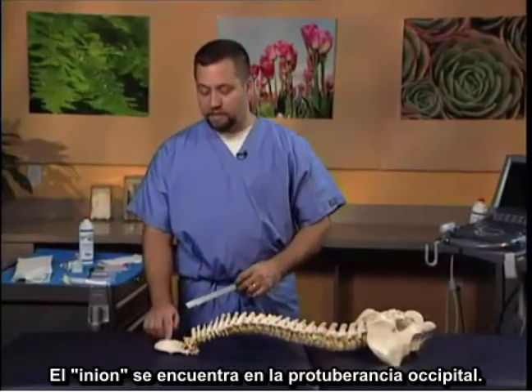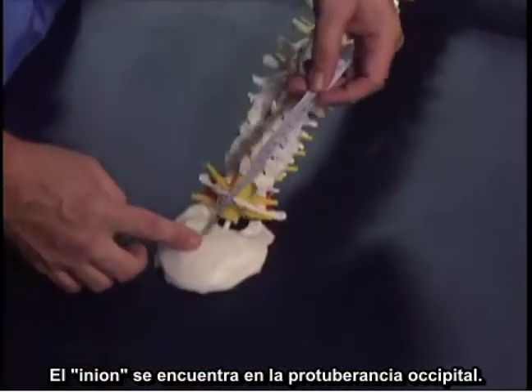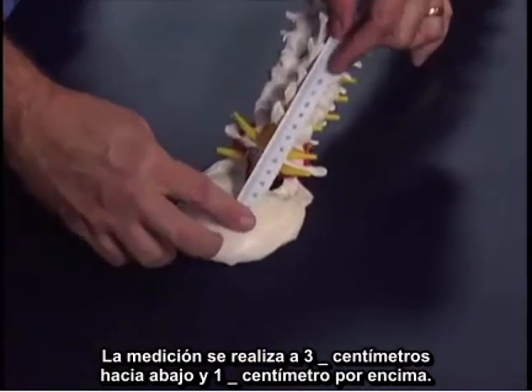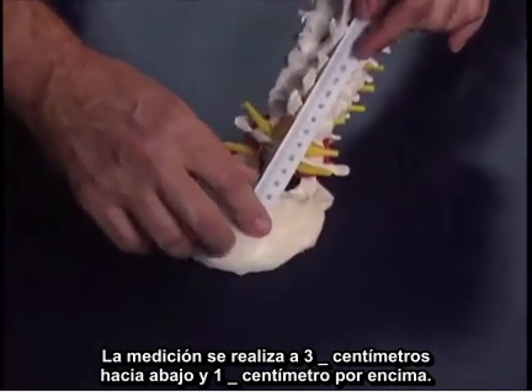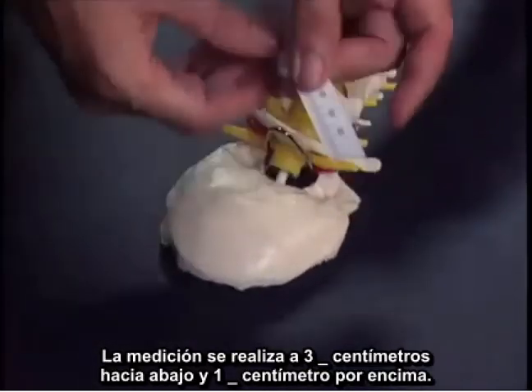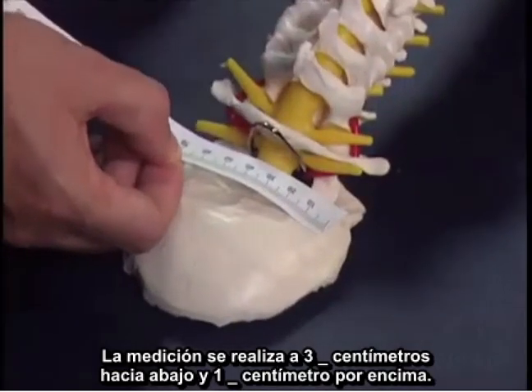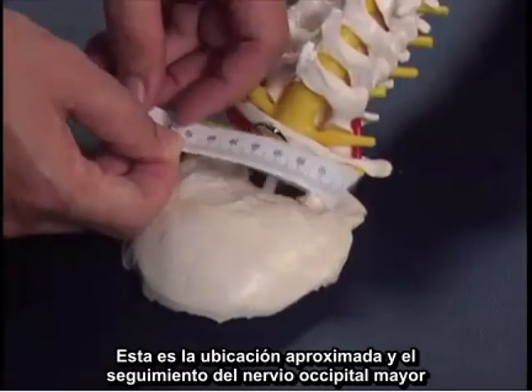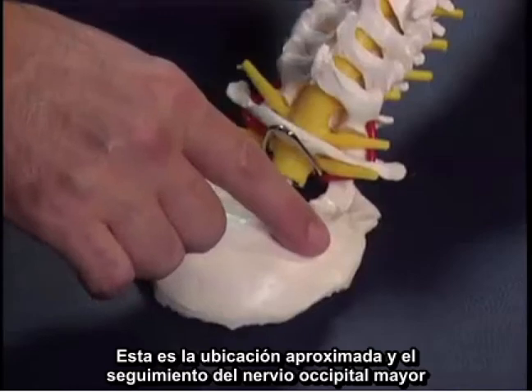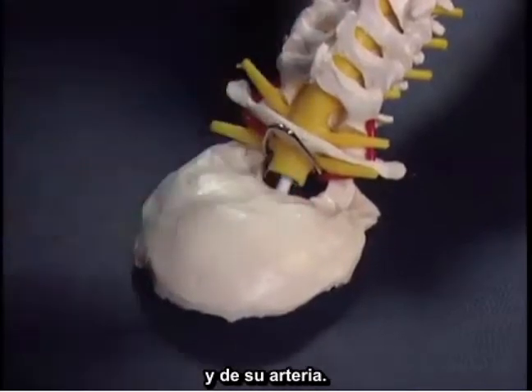The inion is located — the occipital protuberance. The measurement is made three and a half centimeters down and one and a half centimeters over. This is the approximate location and the tracking of the greater occipital nerve and the artery with it.